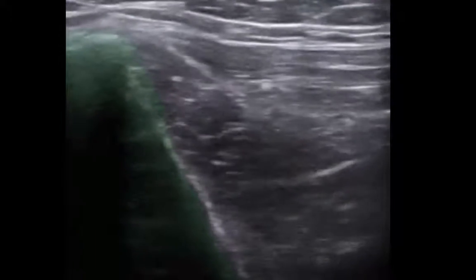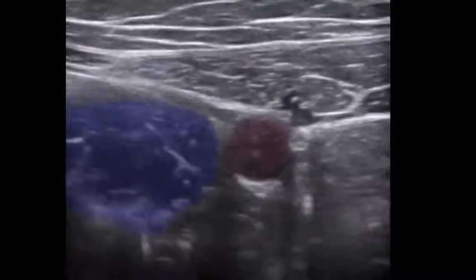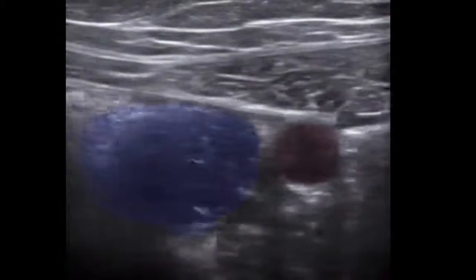So here are the landmarks that I was talking about. Over there on the left side of the screen in green, you'll see the iliac crest. If you go medial, you'll see in red the iliac artery and then the psoas muscle in blue. Those are kind of your big landmarks.